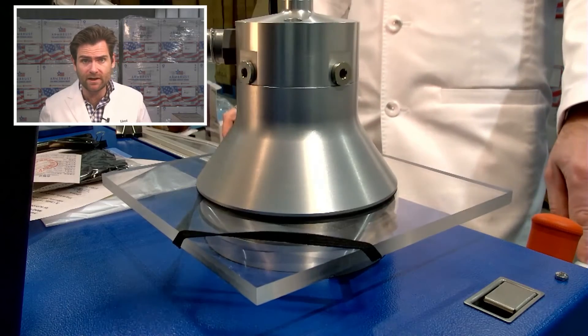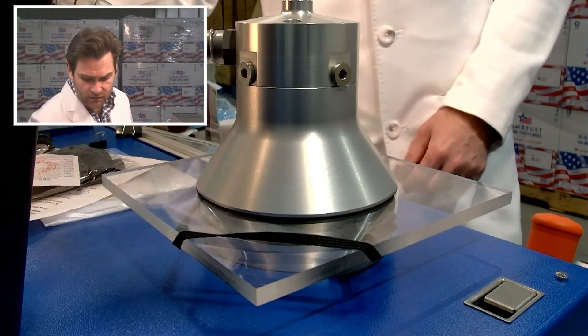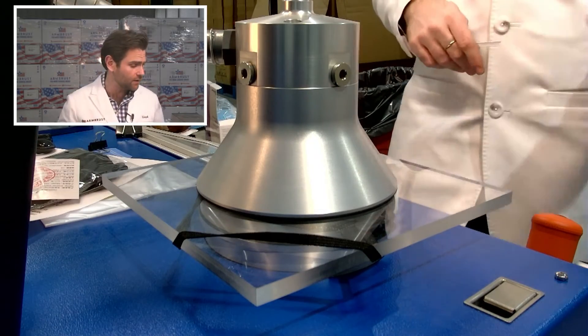And let it rip. This is a PFE machine — particulate filtration efficiency machine. We're doing the N95 test using a TSI 8130A, doing the same test that NIOSH does on an N95. So no one can say I'm not being fair.